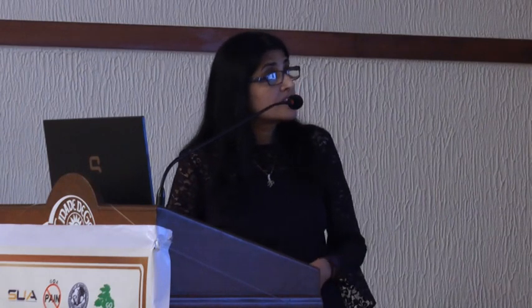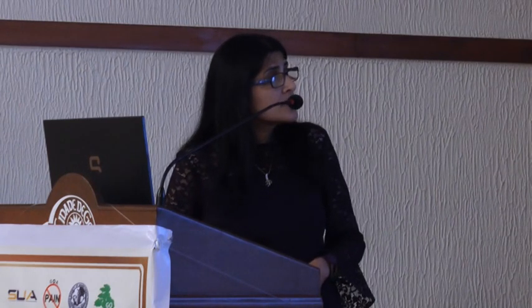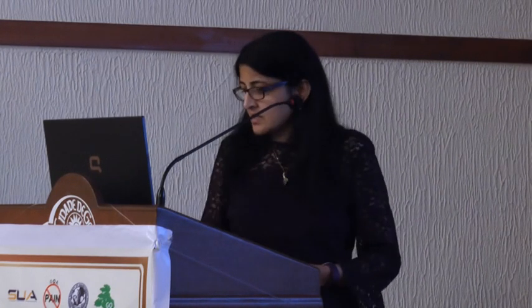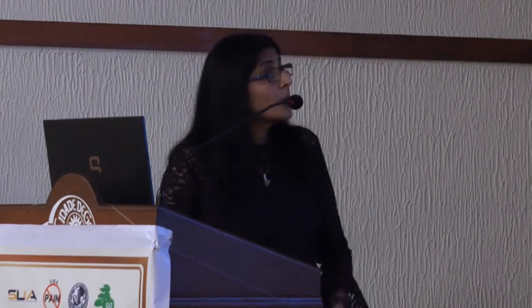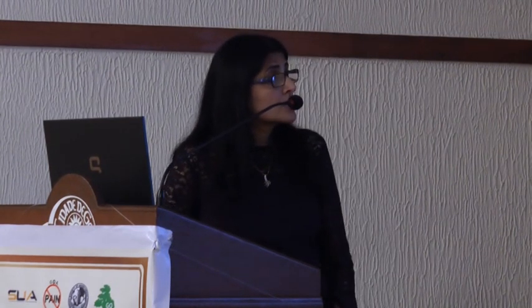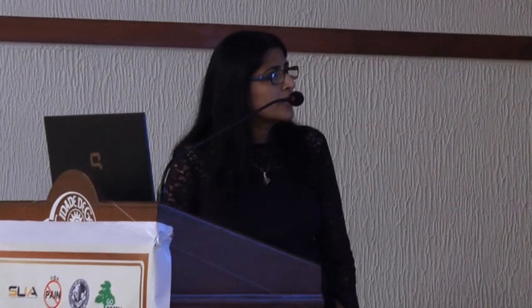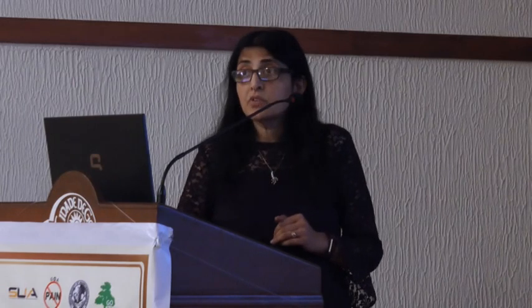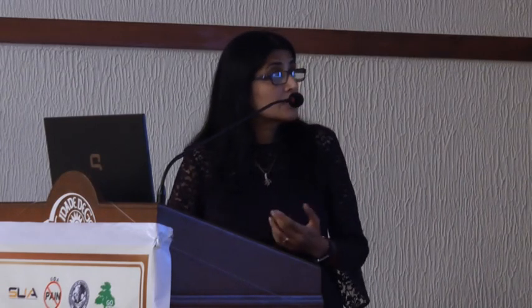Now, how can you do this? It's very, very important to identify the phrenic nerve. It crosses the anterior surface of the anterior scalene muscle from lateral to medial orientation, as you can see here. And this is how it will look on the scan. So this is your middle scalene, anterior scalene, your brachial plexus just there, and your phrenic nerve is seen as a hypoechoic structure. If you scan up and down the neck, you will see this hypoechoic structure sliding up and down the anterior surface of the scalene muscle.